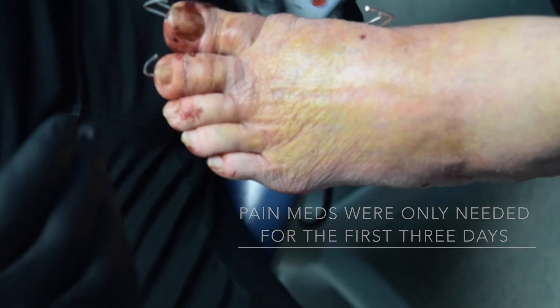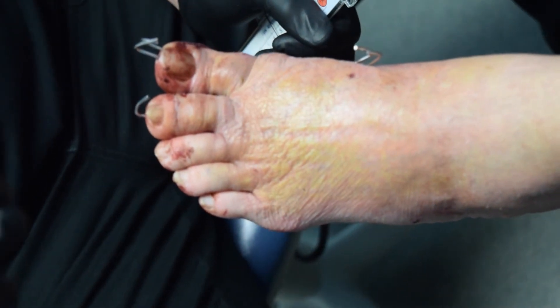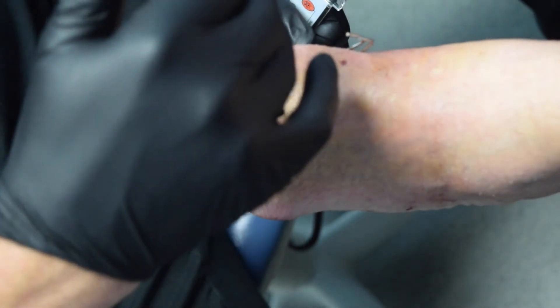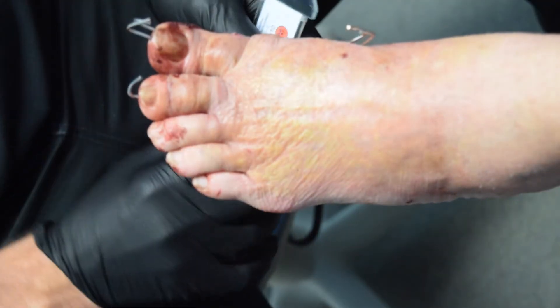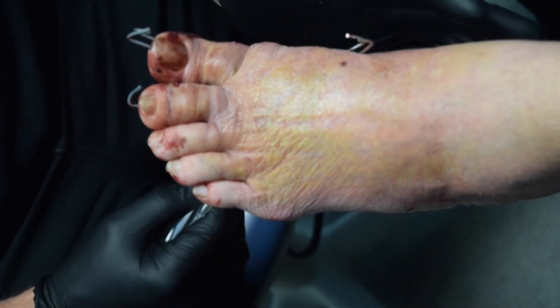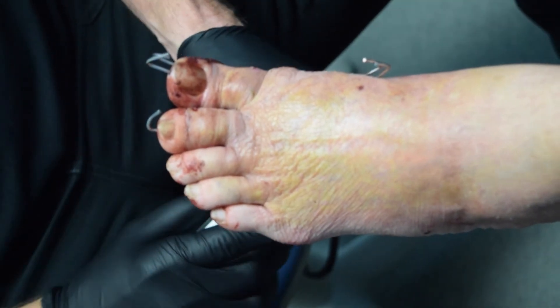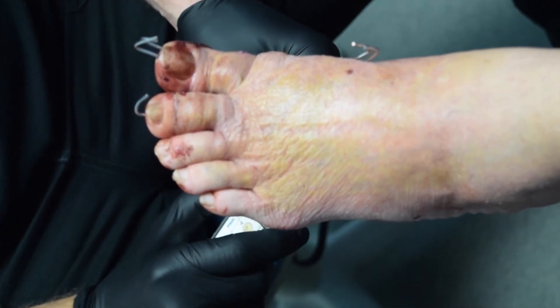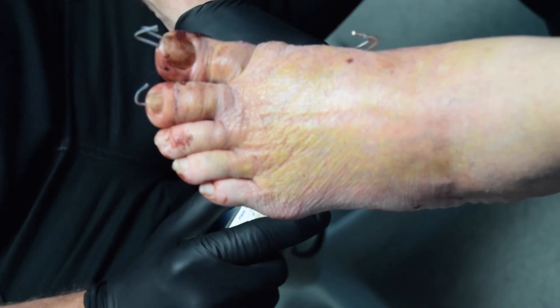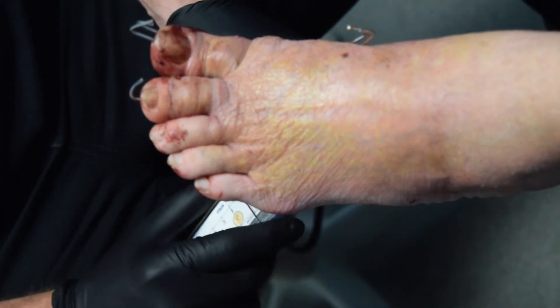The K-wires we use have a diamond-shaped end, so when they go into the bone, they hold very steady. You can see in the x-ray we're likely going to get primary bone healing, or just very mild secondary bone healing — very stable. You can also use screw fixation if desired, but most people opt for K-wires. I prefer K-wire fixation because once it's out, it's out. Some studies have shown screws frequently need removal — one study of 25 patients required removing 9 screws. With this method, we don't have to remove screws.